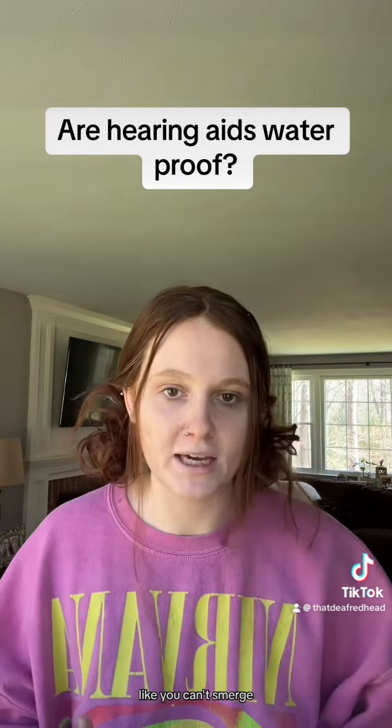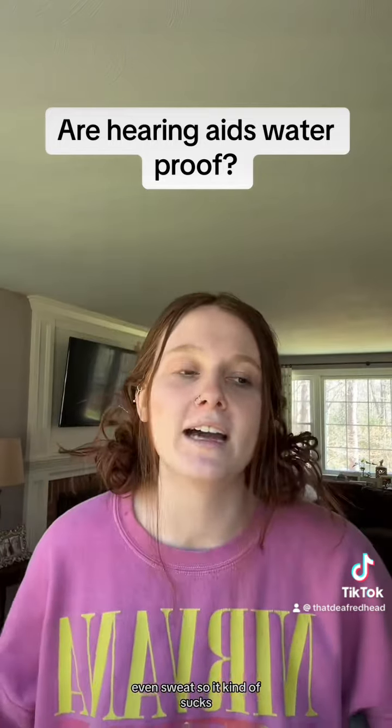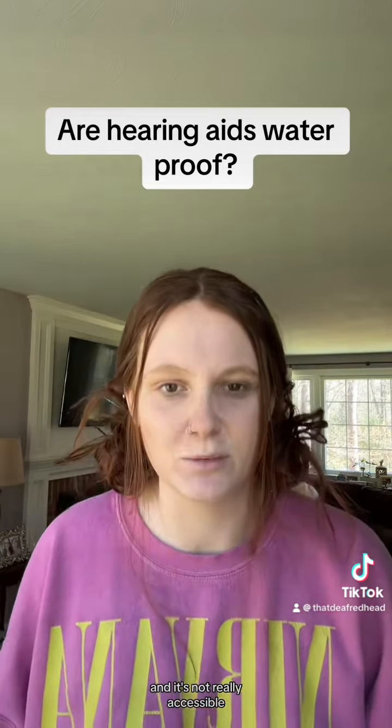They're not waterproof. Like you can't submerge, you can't do any water activity, even sweat. So it kind of sucks, and it's not really accessible.